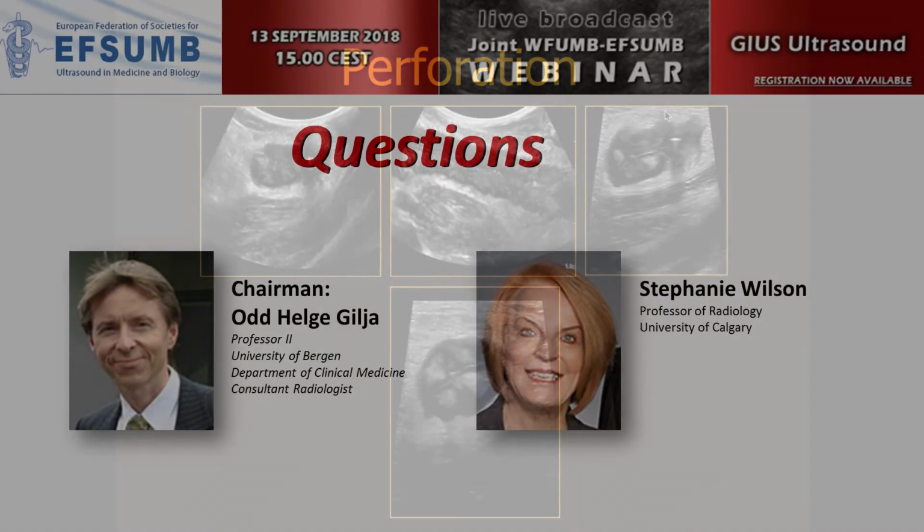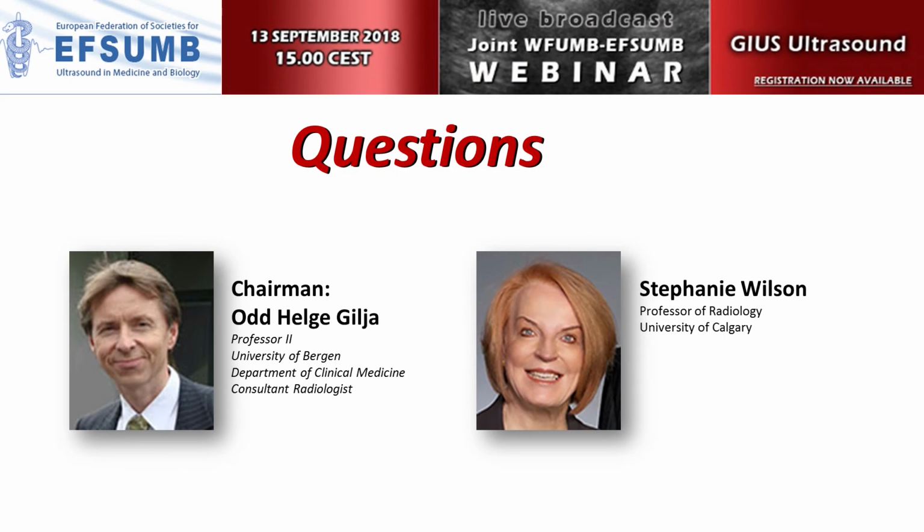Thank you very much, Stephanie. This was a very nice lecture with extensive cases, and we have learned very much. And we have some questions from you, from the audience out there in the world. We have one from India. He asked, we see a lot of tuberculosis in the GI tract. Do you think that gastrointestinal ultrasound has any role in differentiating Crohn's disease from GI tuberculosis?